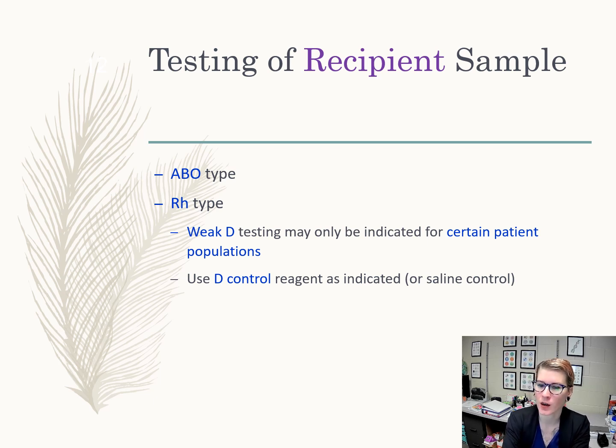So in common talk, when you say RH, you just mean D. Or even once we say a full RH serology, we're just talking about the common RHs, which are D, big C, little c, big E, little e. But usually we're only doing D typing.